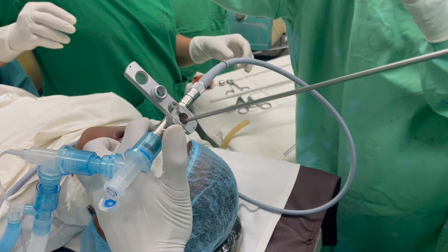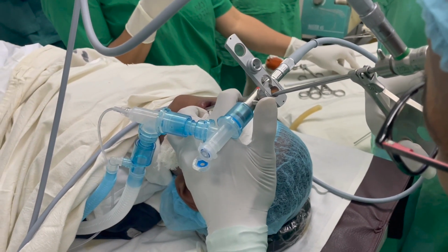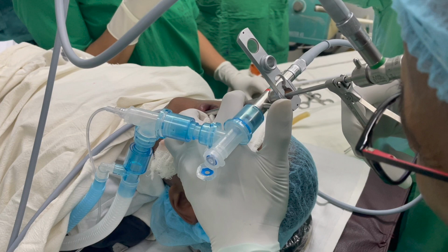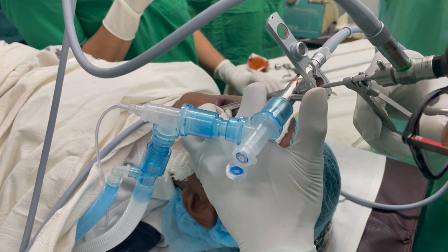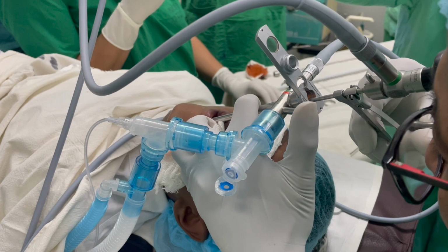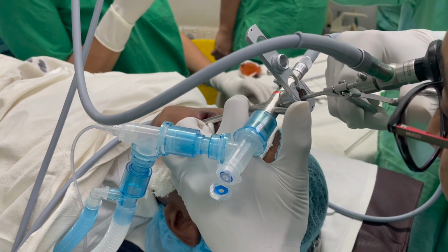This video provides valuable insights into the world of interventional pulmonology and showcases the expertise and dedication of the medical professionals involved. It serves as an educational resource, highlighting the use of rigid bronchoscopy for foreign body retrieval and its role in ensuring optimal patient outcomes.